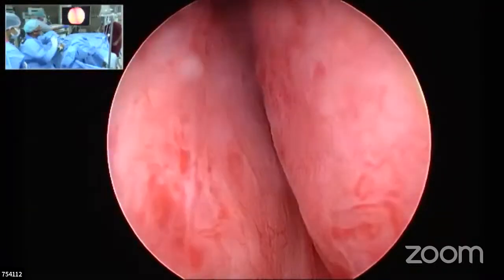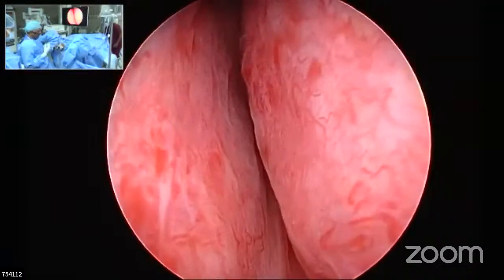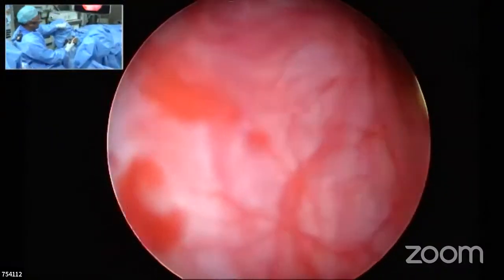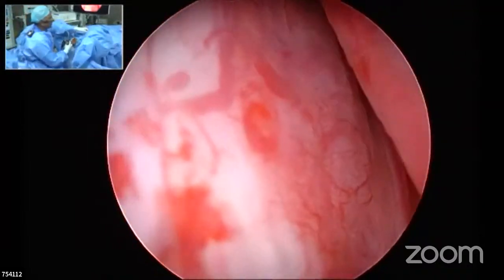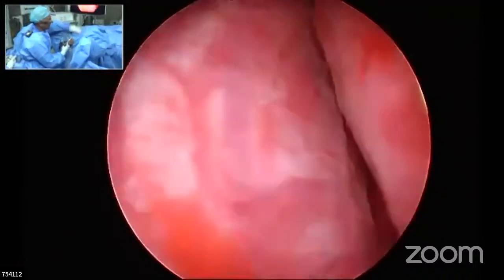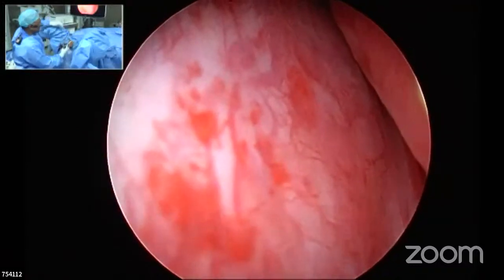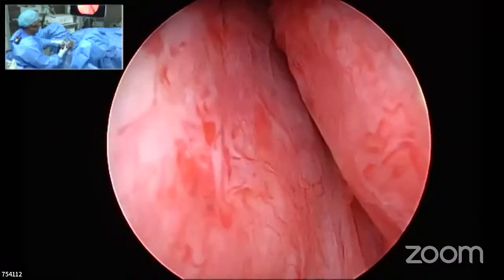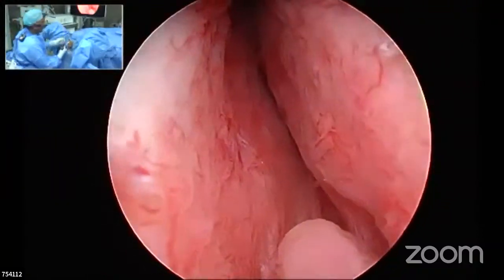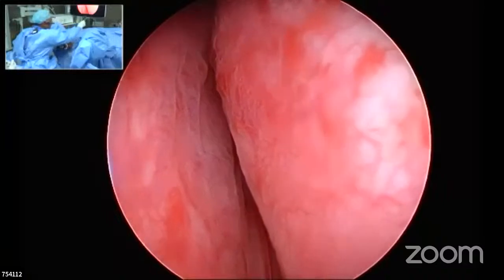So we look at resection. What I was talking about was head down a little, because for a beginner's sake, the experienced resectionists have their own modalities of doing a resection. I always tell all the rest of the people that whenever you start resecting, do not have these loops and cables hanging on to you. The first thing that has to go is the irrigation tube, which is not going to be moving at any point of time. So that has to come onto the table first. Next comes the heaviest one, the light cord, which comes later. The other two, which are going to be mobile and will move in and out whenever you are trying to empty, have to be a little wider and possibly have a little overhanging. I see many people having the light cord cable hanging here, and it puts a lot of weight onto your hand. That's ergonomically not an ideal position to work with.